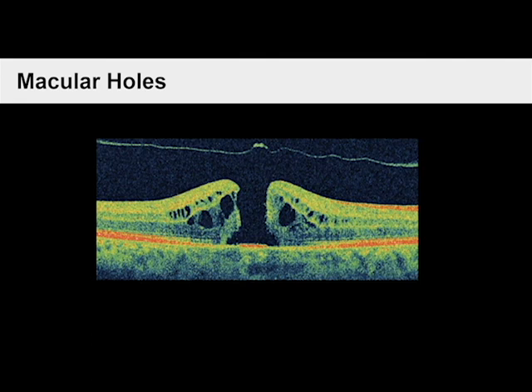Because it is non-invasive and quick, OCT is commonly used in the diagnosis and management of retinal disorders. Macular holes, which occur when vitreous or fluid in the eye shrinks and pulls away from the retina, is a condition that blurs central vision. The macula is the small, light-sensitive area in the center of the retina. This condition can be caused by aging and stress. A stage 3 hole, which is seen here, is completely hollow. The majority green in the image indicates intermediate reflectivity.